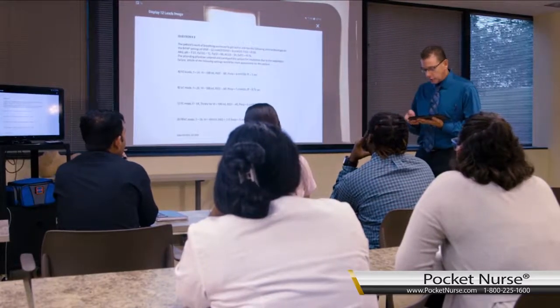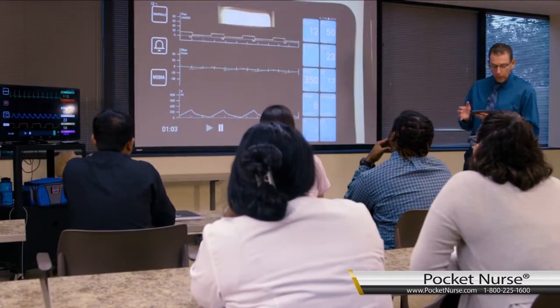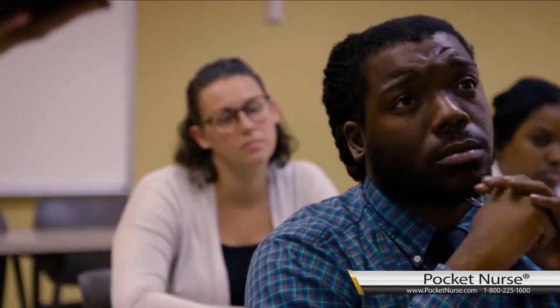You can also use it as a testing scenario. So you can just call up the simulation and then run them through a test, and you can see whether the student grasped the concepts from the education to the testing piece. One of the biggest benefits of simulations is to provide a bridge from the classroom and lab setting to transitioning the student to the hospital. We really want the students to be prepared when they enter the hospital to take care of patients. And VentiSIM is the closest thing that we can provide to put the student in a real-world scenario.